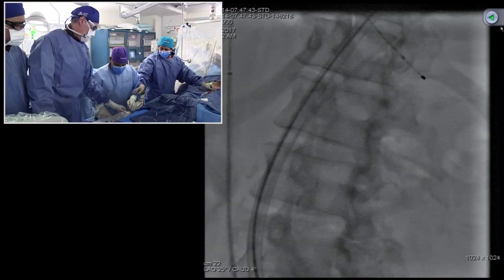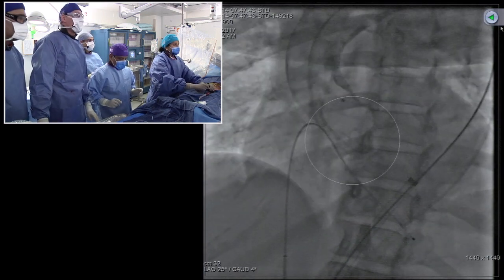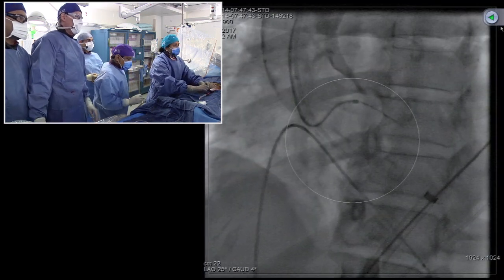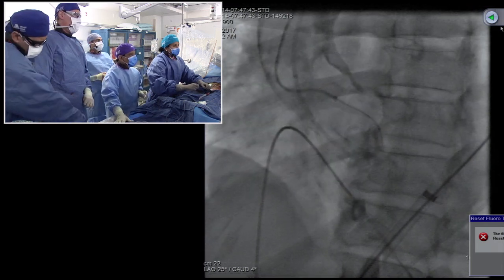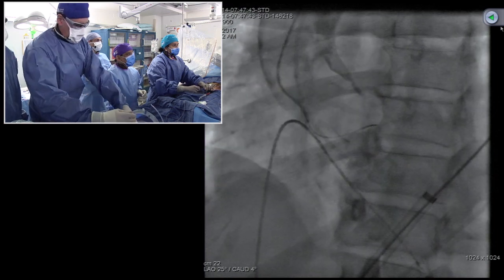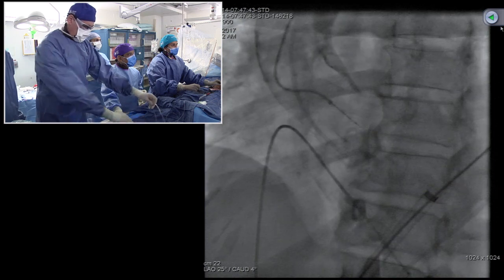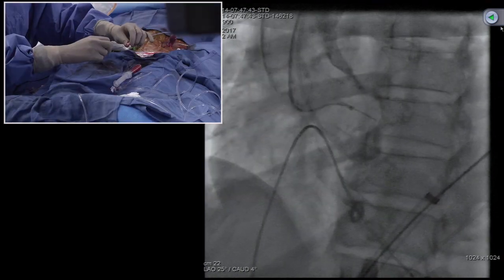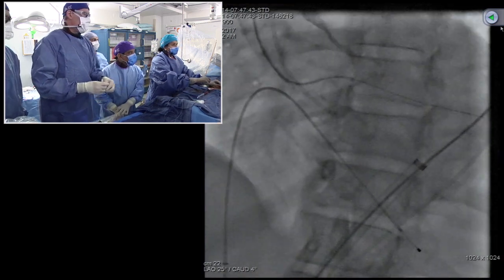Now, that's a very interesting point which George has brought, that during the CT scan itself, we knew the arch vessels were very tortuous. In many cases where we know, based on the CT scan, that we are able to do the Sentinel device, we will still do an arch aortogram and then make a decision whether it is worth doing the Sentinel device in the case.